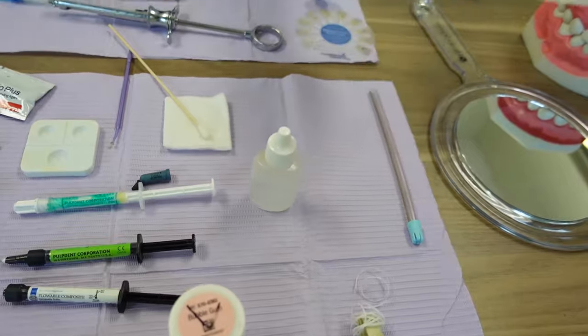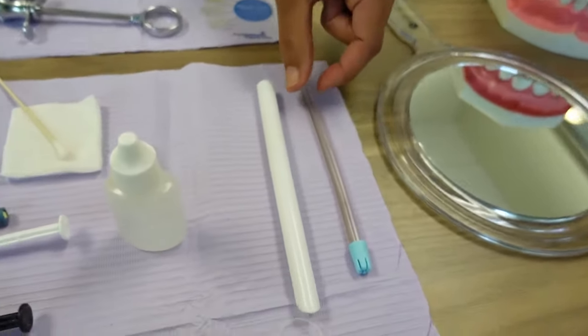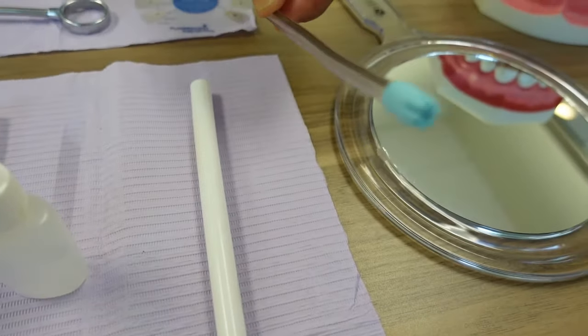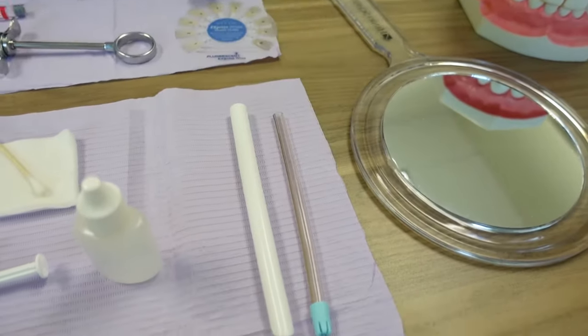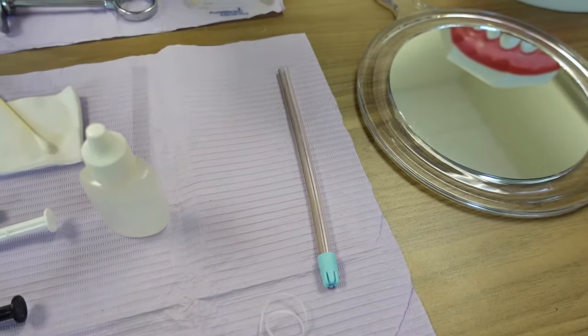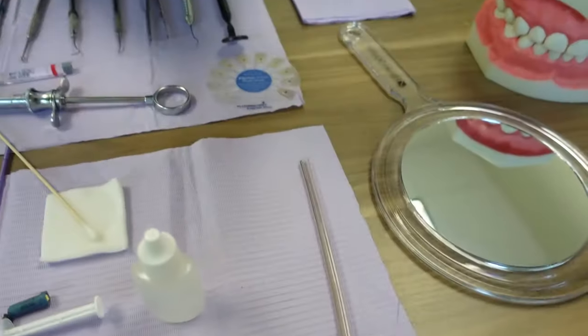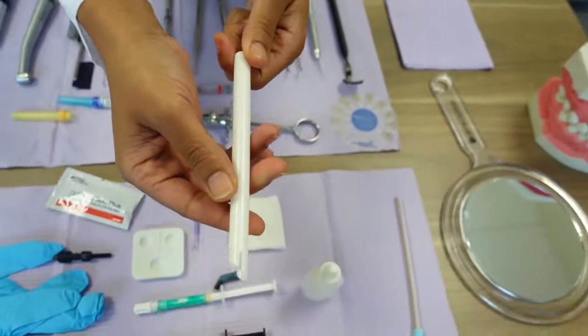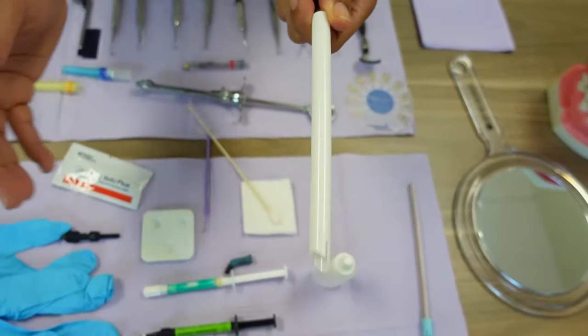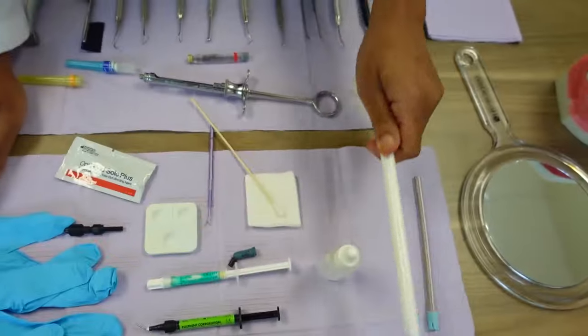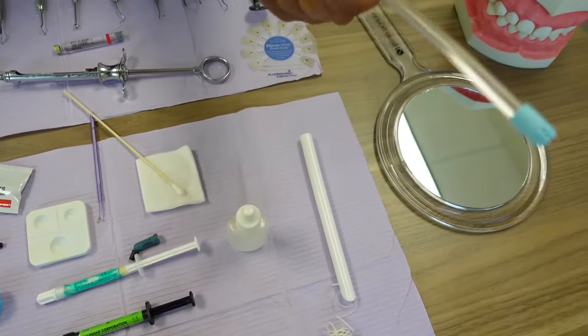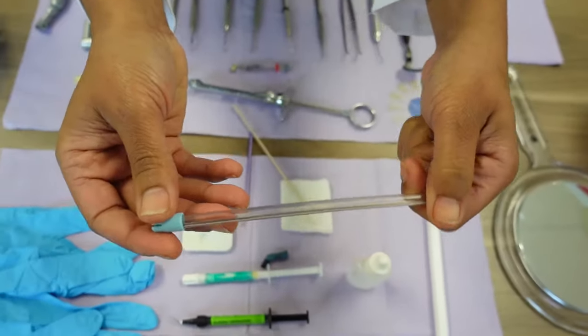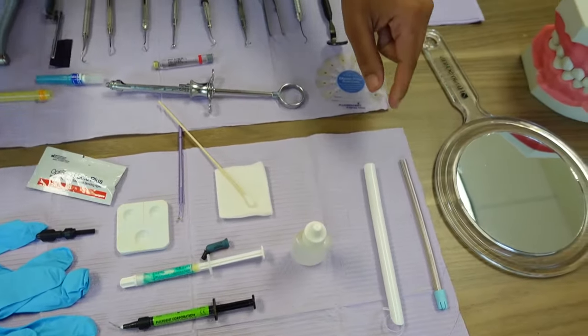This is an HVE—high volume evacuator. This is a saliva ejector. The HVE is used to remove excess debris in the mouth and filling material, anything else that the patient can swallow. The saliva ejector is used to remove saliva.